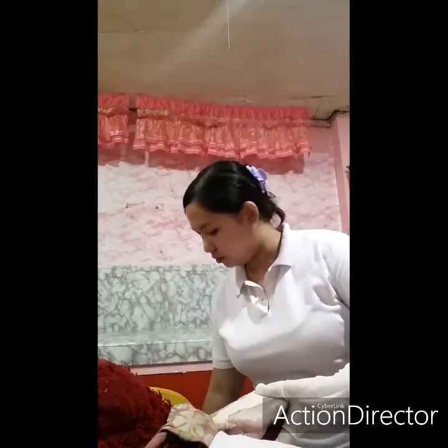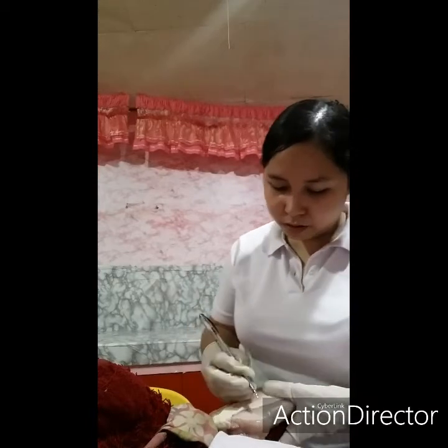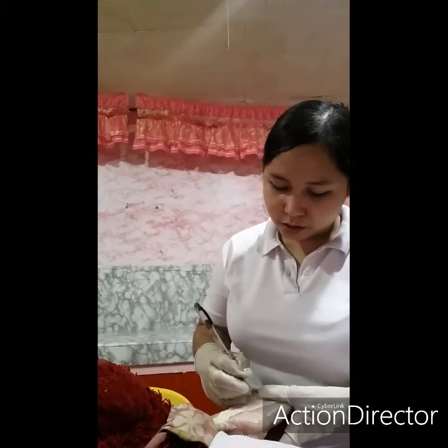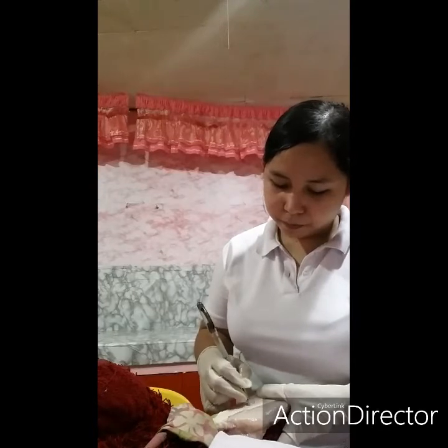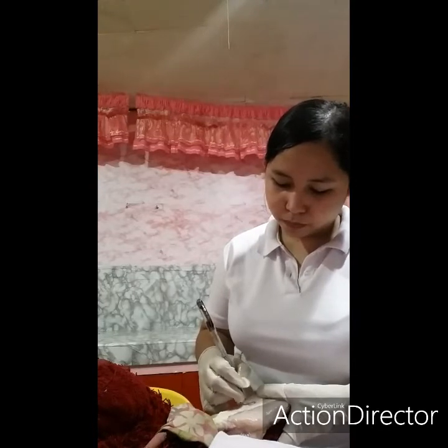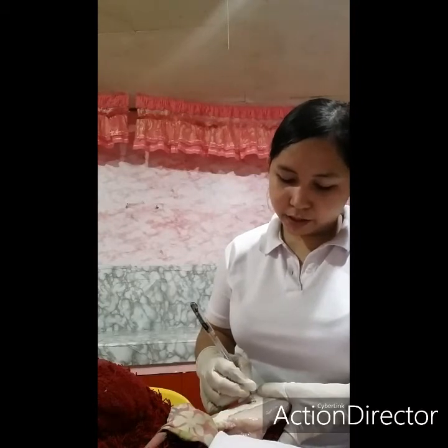Then label: encircle the wheal. Write the date and time we injected.